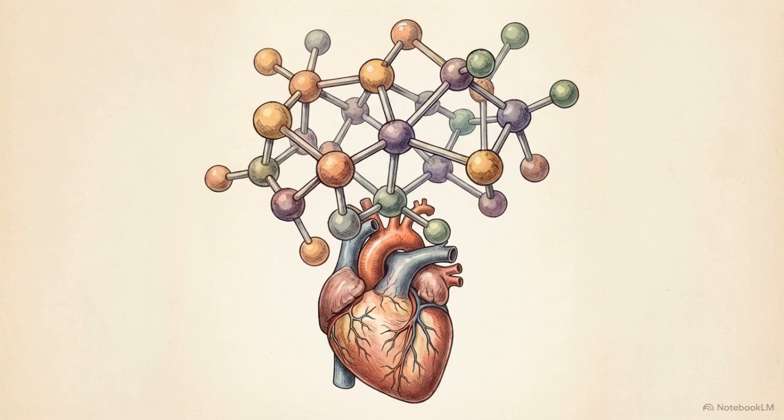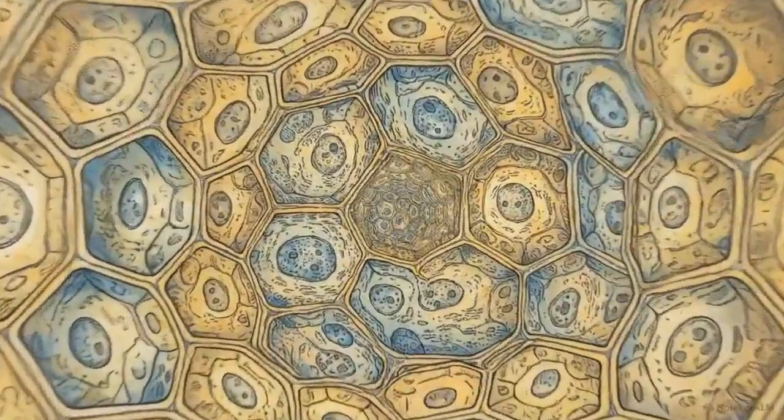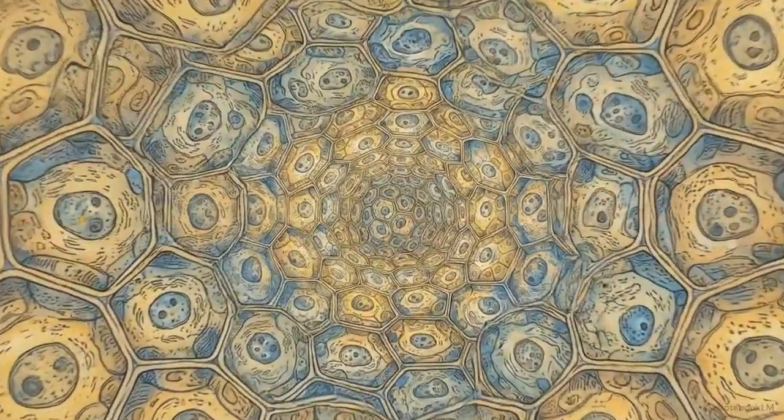Board-level nuclear medicine is the observation of localized cellular biochemistry scaled up to a macroscopic level. By mastering each of these localized cellular mechanisms, the macroscopic patterns on the scan become entirely predictable and identifiable.